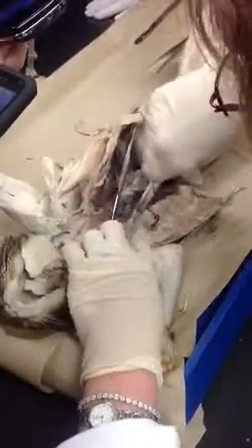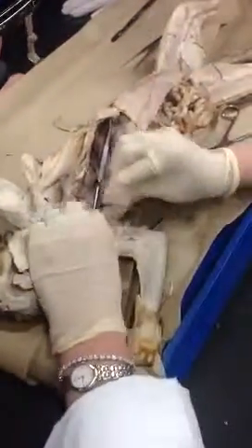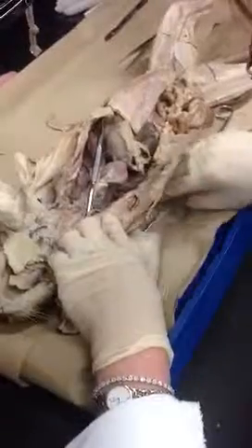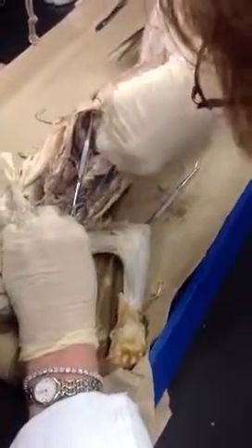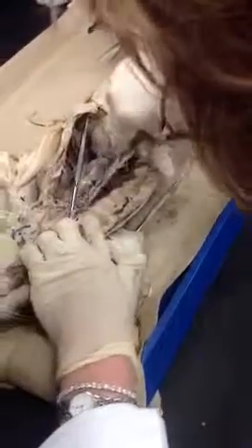See how I'm kind of just sort of kicking my way through here? Break it back. Yep. Whatever you need to do. And again, we don't want to cut that one, but we want to get down to the muscle. Put the vein out of the way because we don't need that.